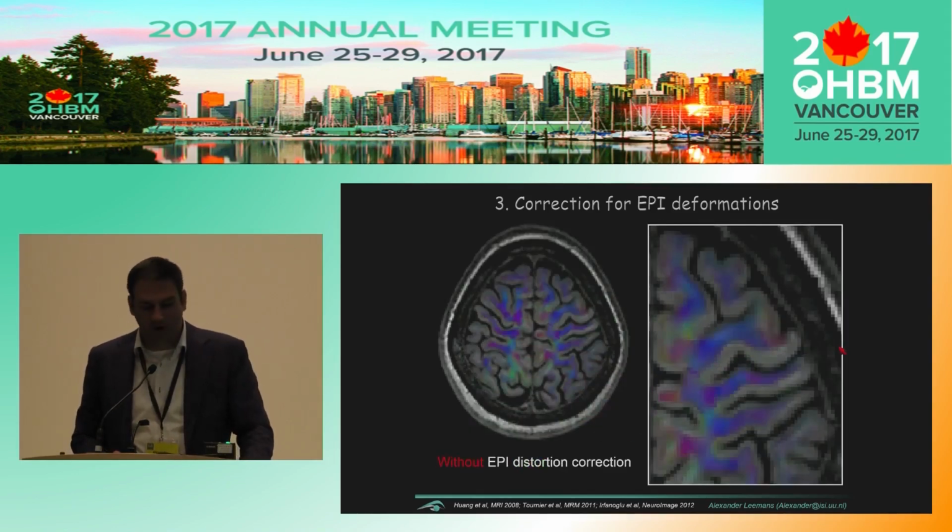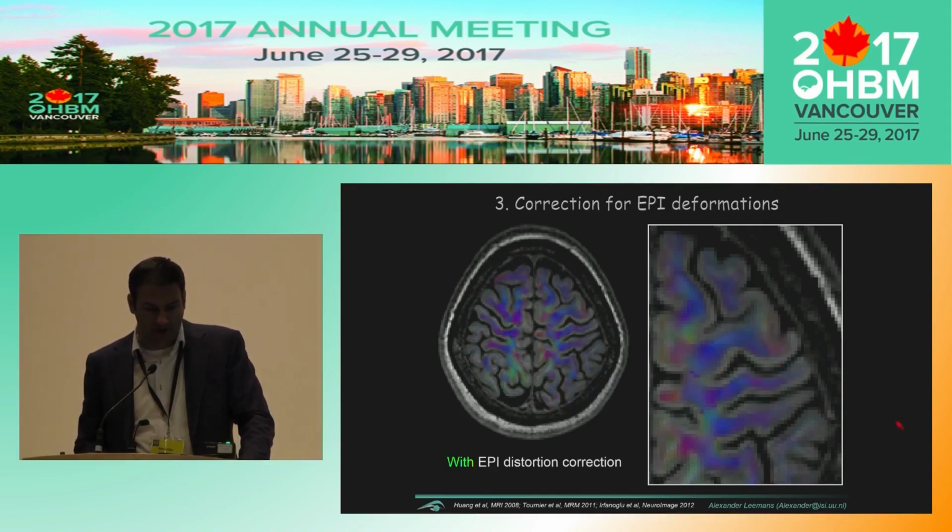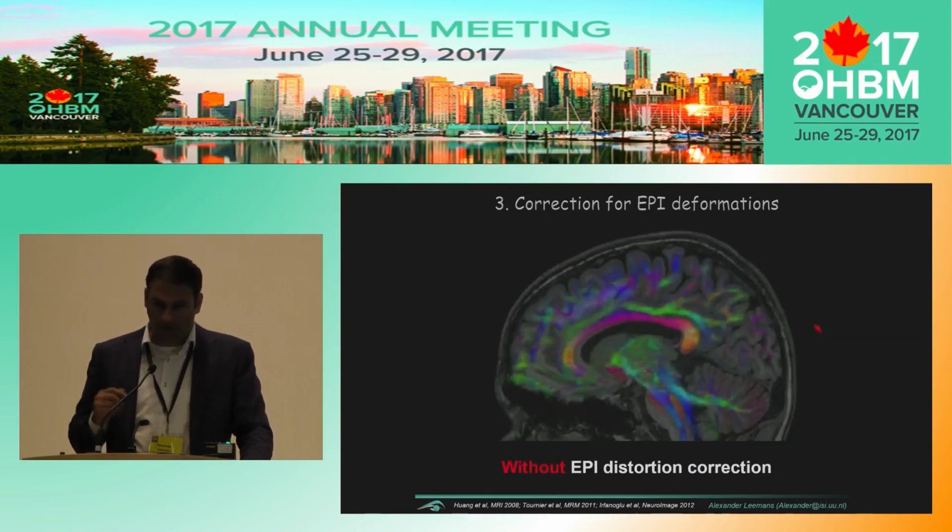And then some people argue, well, higher up in the cortex, the regions there where I'm interested in, I don't see these artifacts. Well, again, if you were to rigidly align them, you may debate, well, is this a good alignment? Well, again, this is before, this is after. And I would argue that after correction, it looks better. And you can see shifts up to 2 voxels, which obviously from a T1 point of view, 2 millimeter, for instance, is significant.